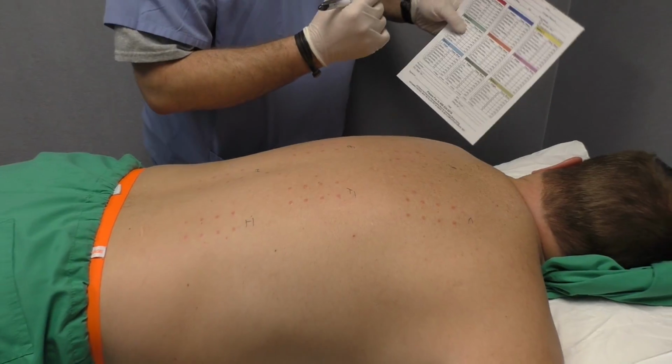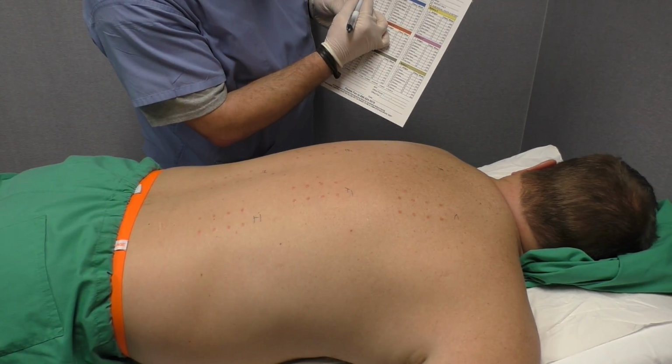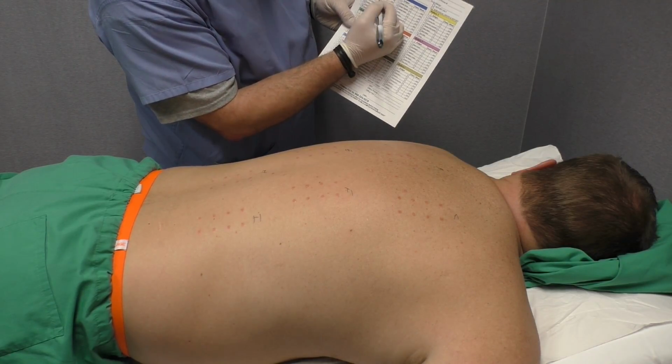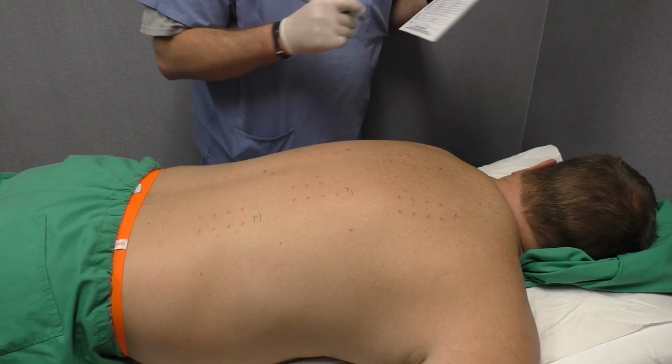So on our evaluation form, battery A1 histamine control, we saw a 5 millimeter wheel. And we will continue to do this for every other wheel that we see in every battery on the patient's back.